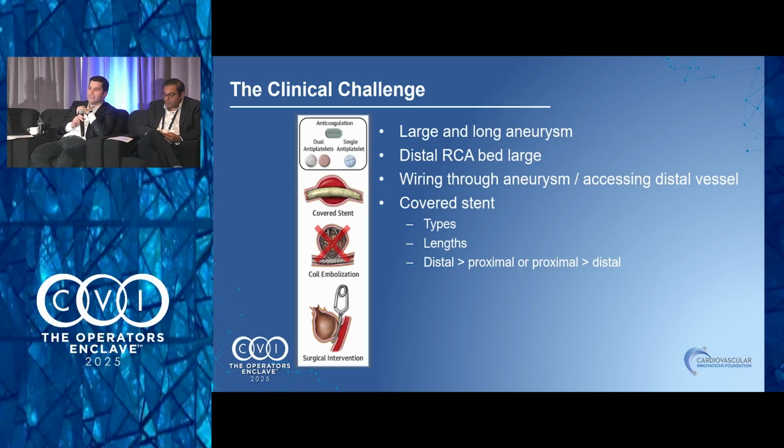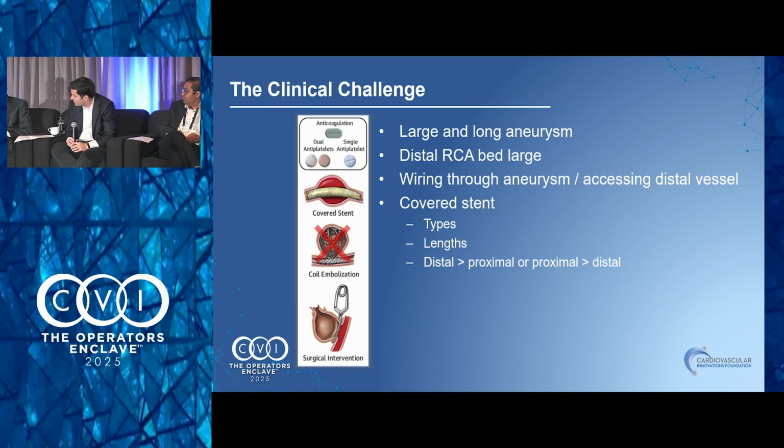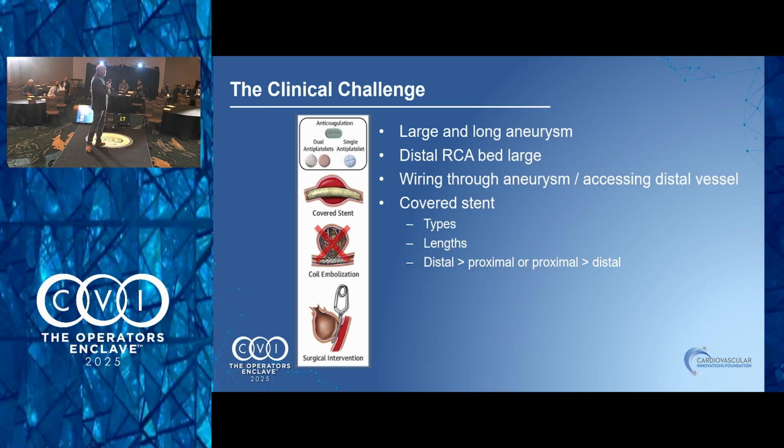Well, we're talking about sending a guide through the proximal to the distal, wiring it there, and then bringing your guide back out and sending everything over. So it'd have to be at least a 7 or 8 French guide, right, for support, and use a Grand Slam or something really stiff, exactly. And then the choices are Viabahns or something else.